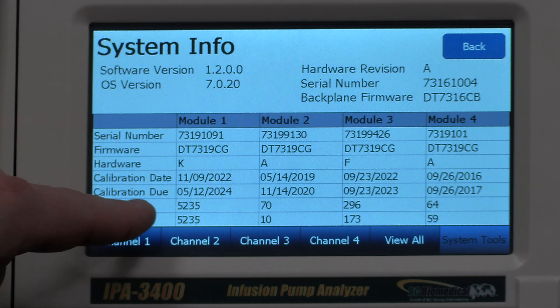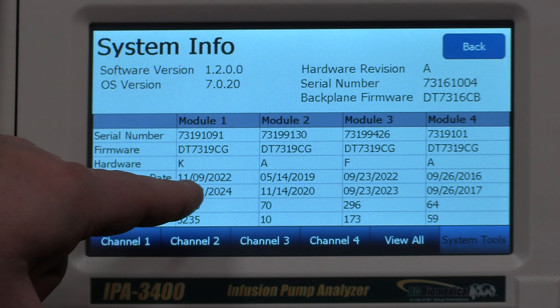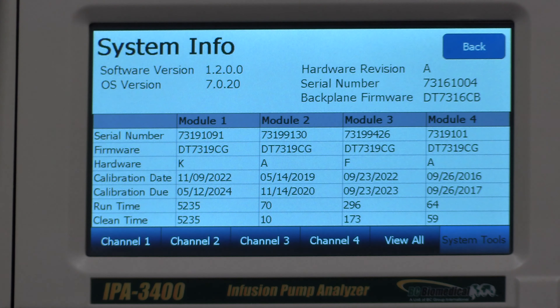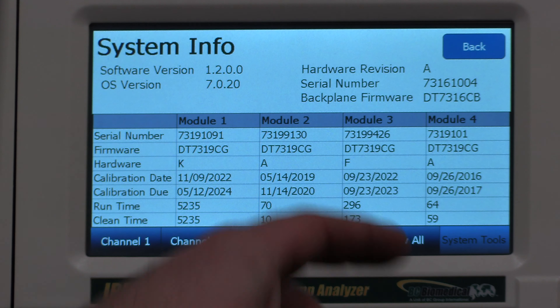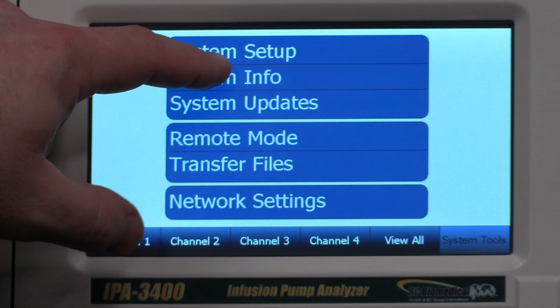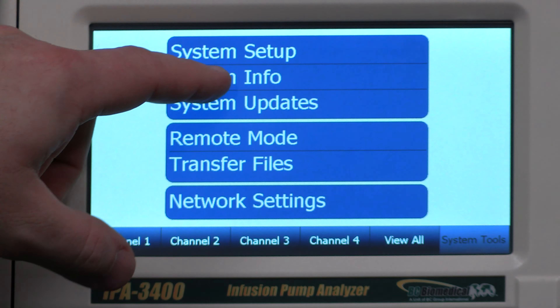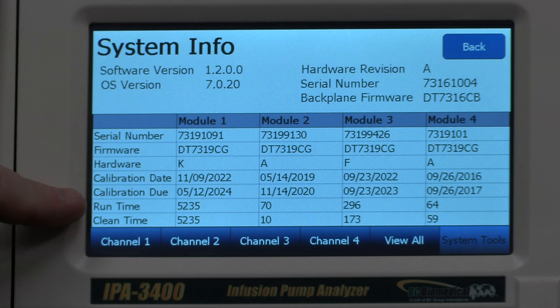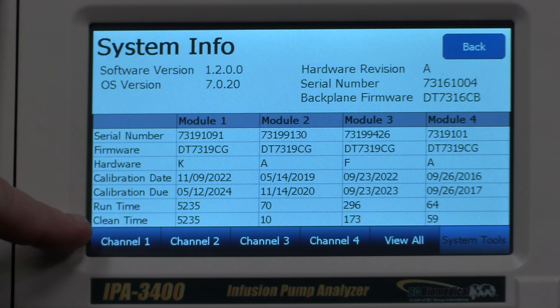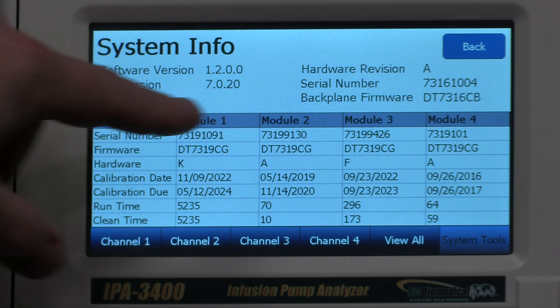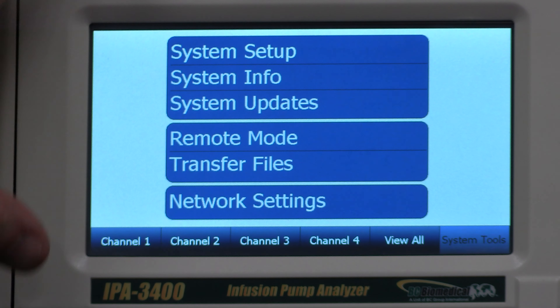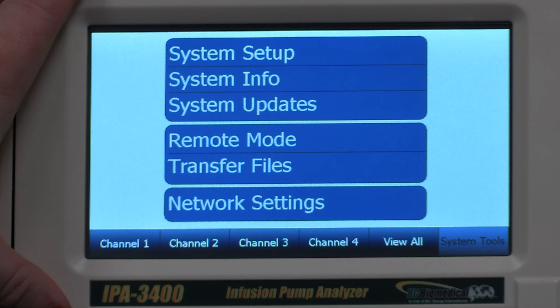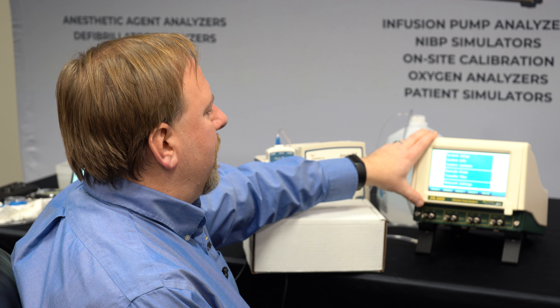Those are the system tools that are available. For the system information screen, this displays our calibration due date. When we need to send a unit back, we can go to this screen and see which units are due for calibration and which ones should be sent back. That's also where we can see how much each module has been used and when it was last cleaned.